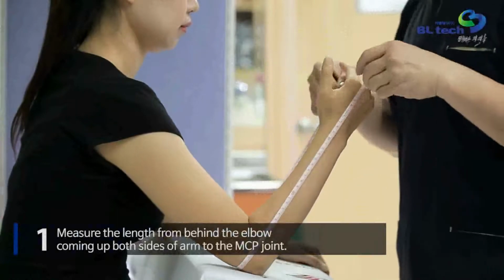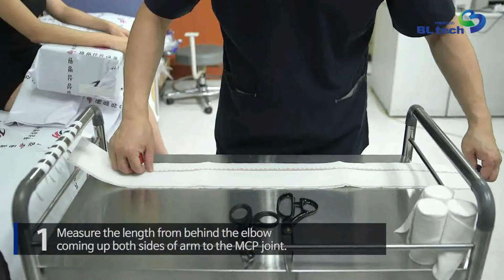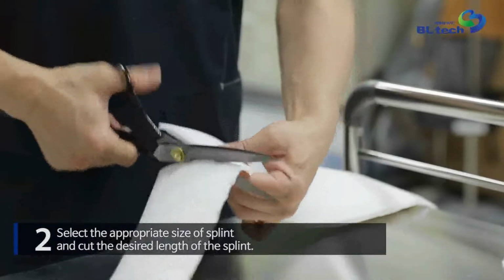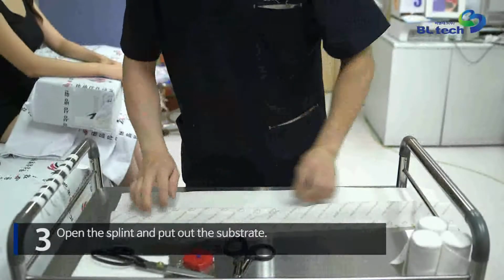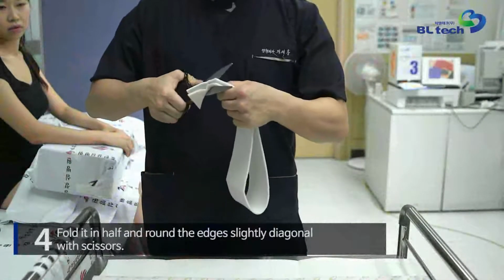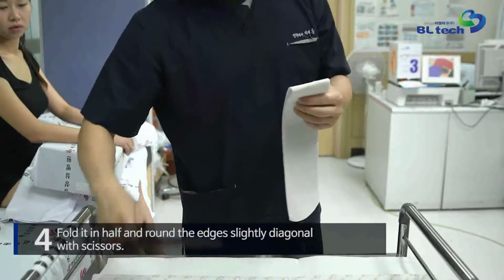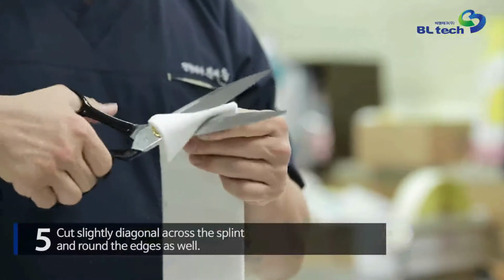Measure the length from behind the elbow, coming up both sides of the arm to the MCP joint. Select the appropriate size of splint and cut the desired length of the splint. Open the splint and put on the substrate. Fold it in half and round the edges slightly diagonal with scissors. Cut slightly diagonal across the splint and round the edges as well.